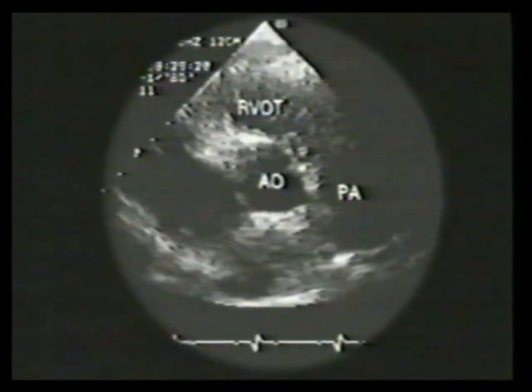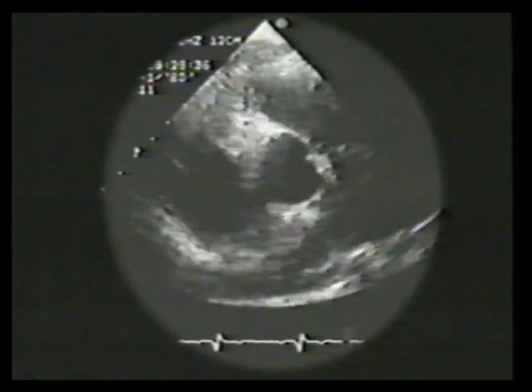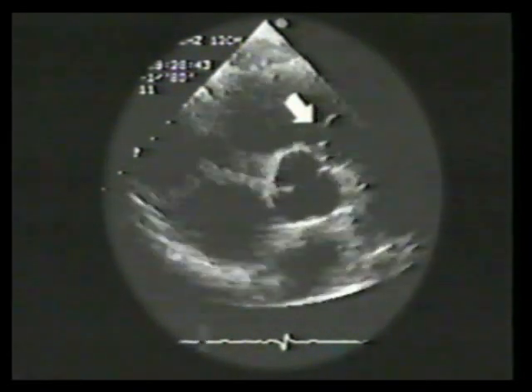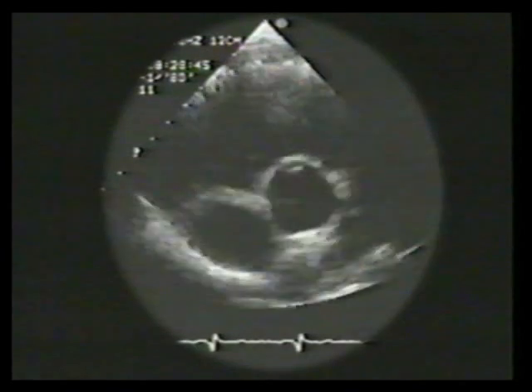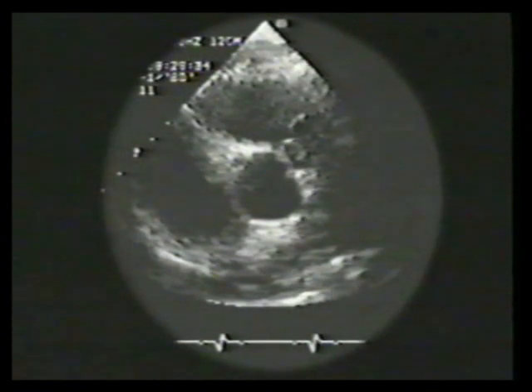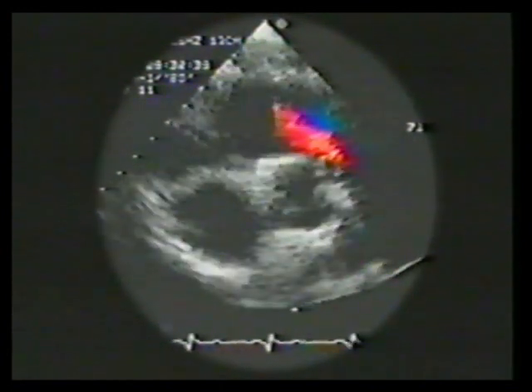This patient also has mild congenital valvular pulmonary stenosis. The transducer is in an upper left parasternal position. A thickened pulmonic cusp is evident. As is often the case, it is difficult to completely visualize systolic opening of the valve. Color flow imaging demonstrates acceleration of blood flow across the stenotic valve with color aliasing. Color flow also identifies moderate pulmonary regurgitation.